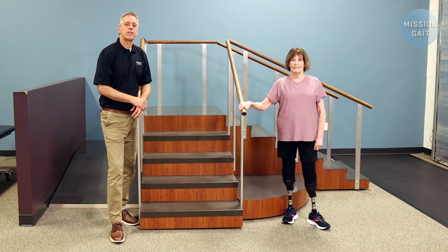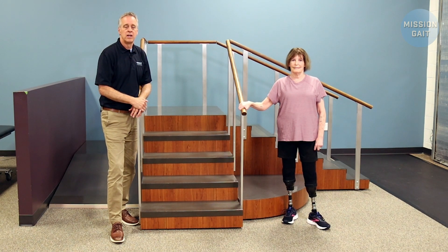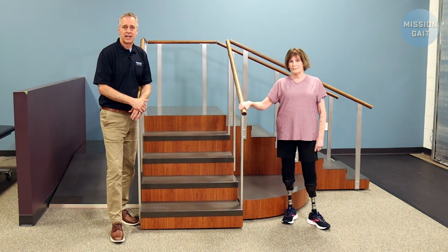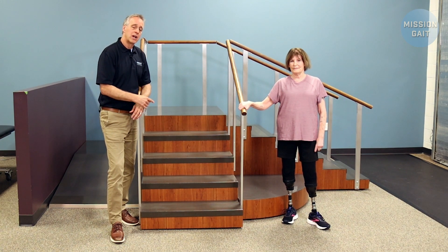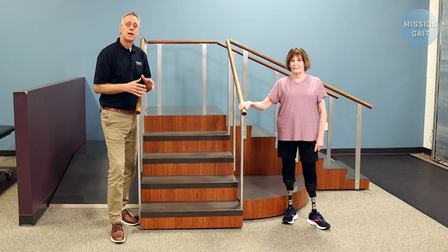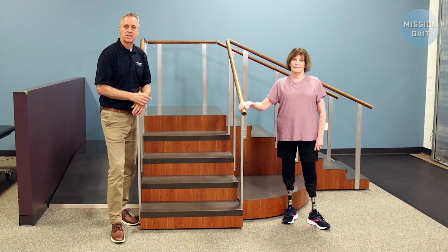Hi, I'm David Lawrence, founder and CEO of the Mission Gate Foundation. In this episode of our You Asked series, we're going to address the issue of going up and down steps with bilateral prosthetic limbs. Before we get started, I want to remind you that if you go to YouTube slash Mission Gate Prosthetic Training Series, there is a video on there on stairs and ramps for the amputee.